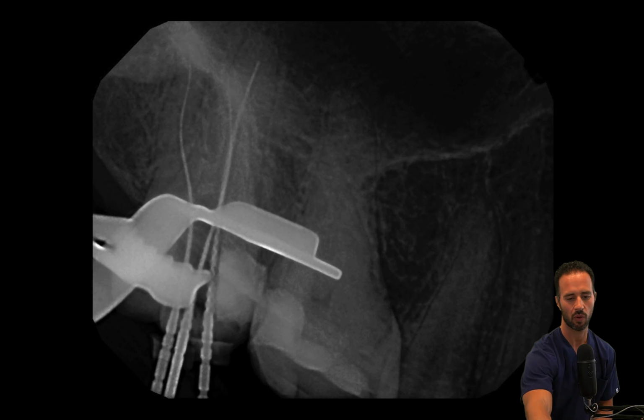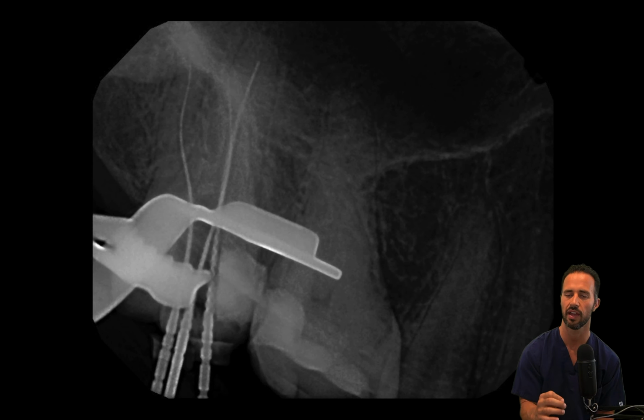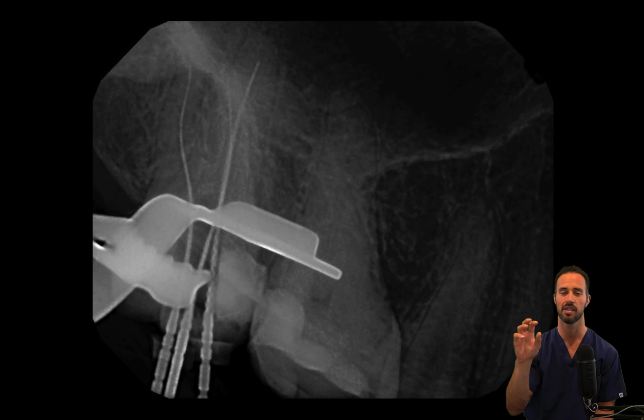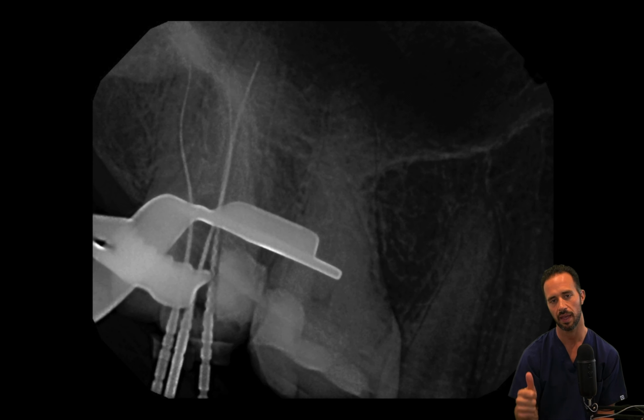And so there we go. We have our working length radiograph here. We can see that the mesial buccal and the distal buccal lengths look great, but the palatal looks a little bit short still. So remember, our working length was found initially to be 18 millimeters. So we're going to increase that working length from here moving forward by 1 millimeter, and we're going to make that working length now 19 millimeters. And remember, that's going to be the same working length that we used in our DB. So our working lengths: MB 18, DB 19, palatal now 19, okay?